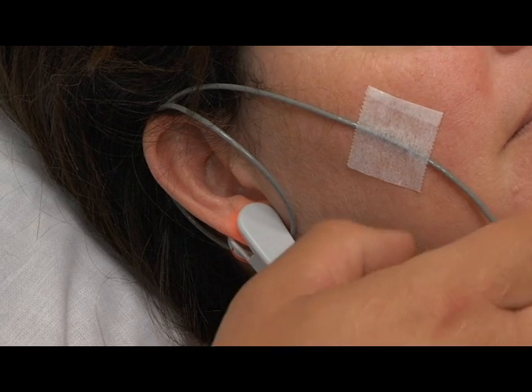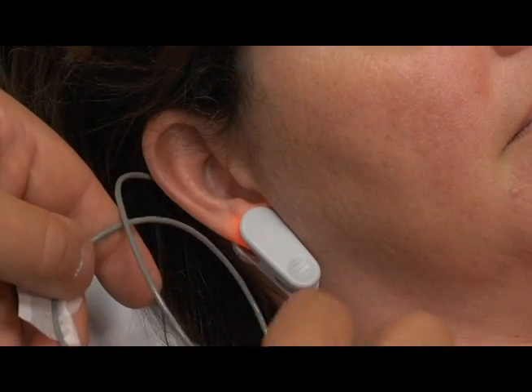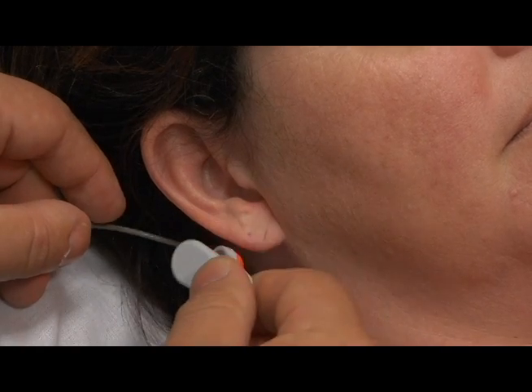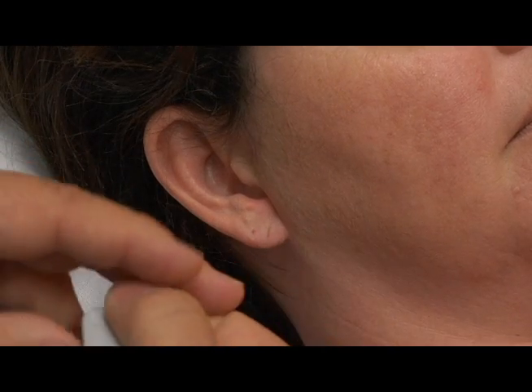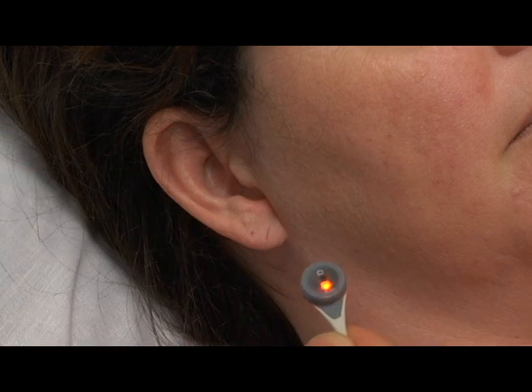Ear Clip: Remove the adhesive tape from the sensor cable and unwind from the ear. Remove the ear clip carefully from the patient's earlobe, then detach the sensor carefully from the ear clip. Alternatively, you may also remove the sensor from the ear clip and leave the ear clip attached to the earlobe for further measurements.